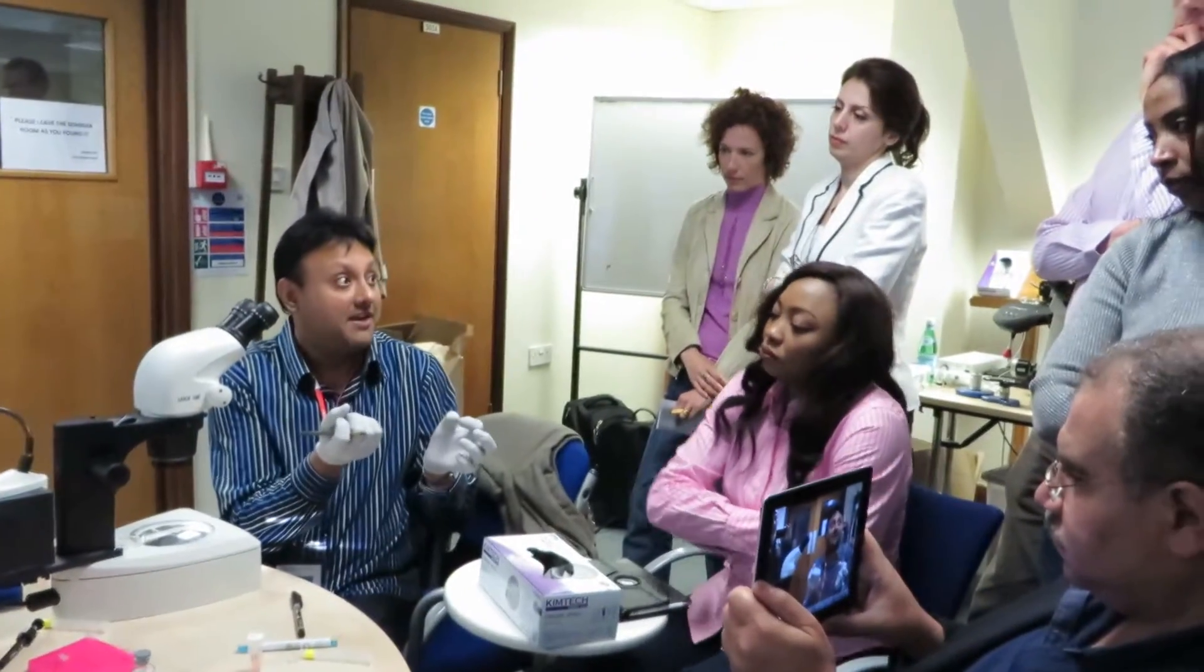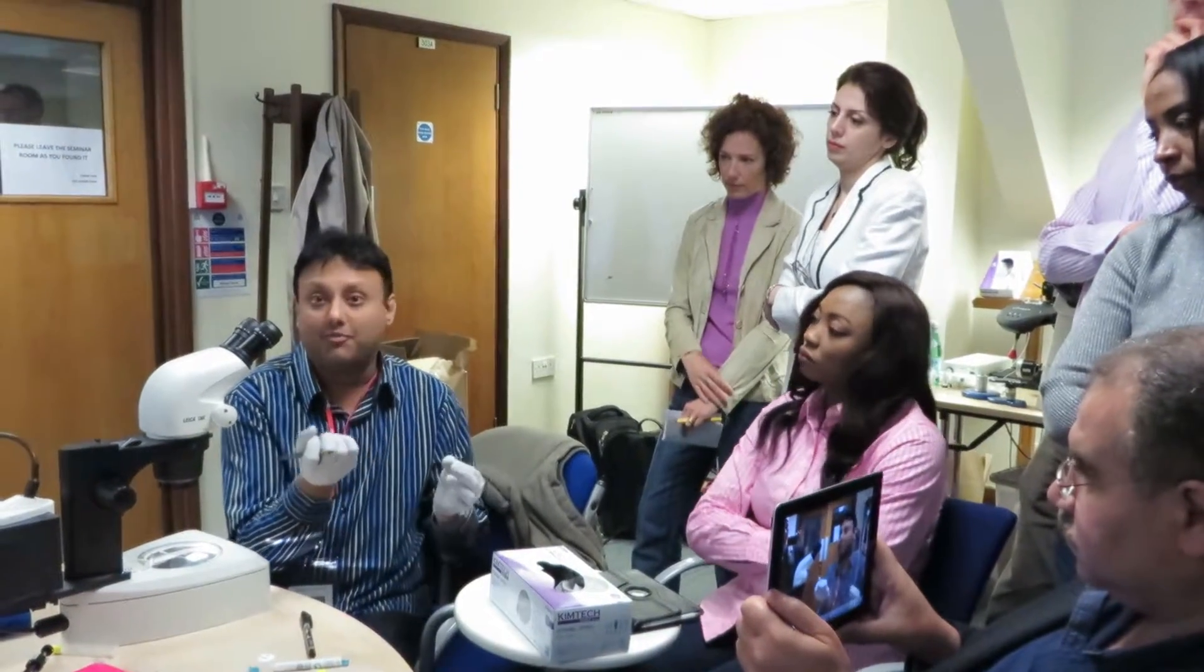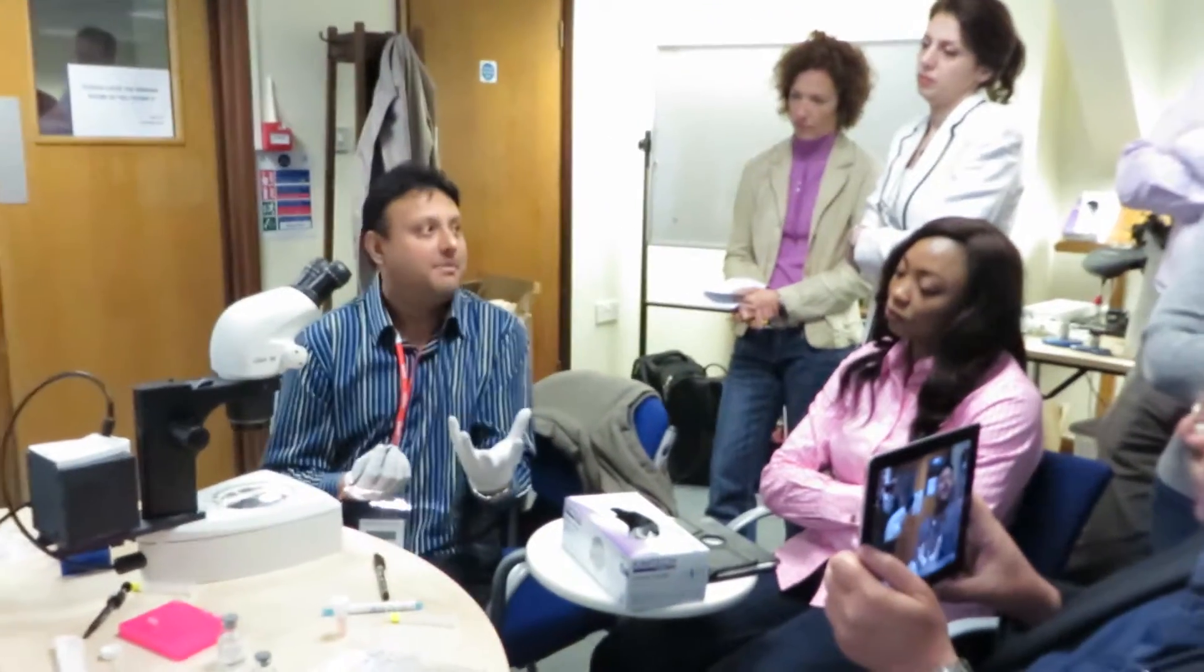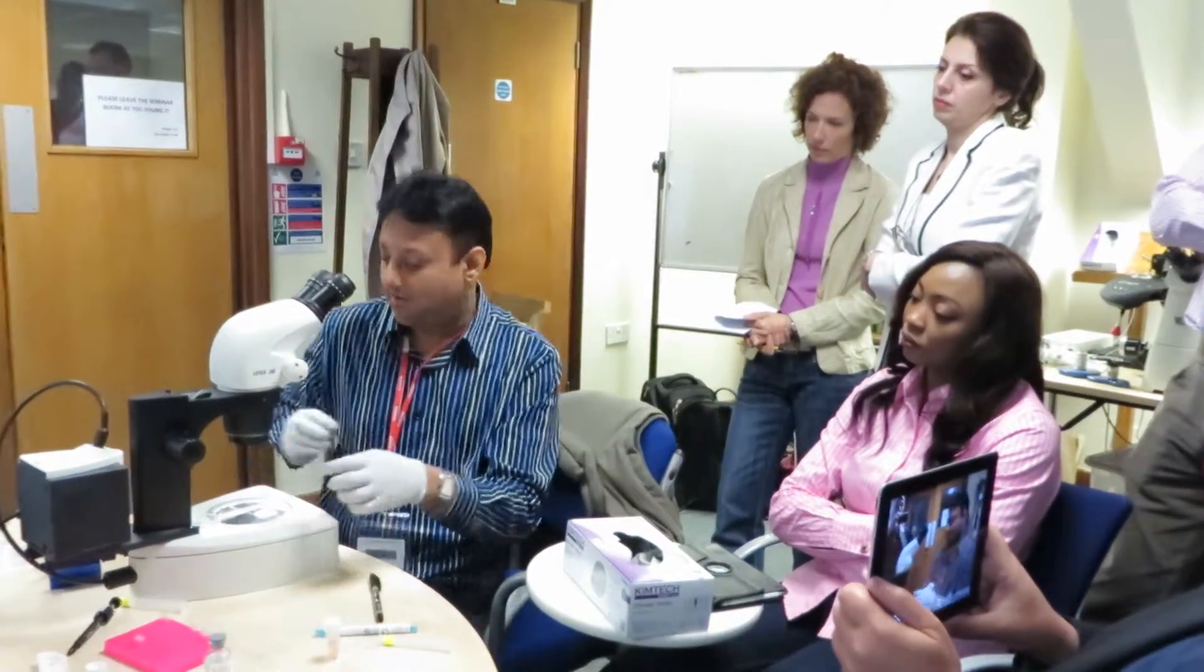As you know, the FISH probes are very tiny in amount. You literally put one microliter or even less, so it needs to go in a very specific area. You can't draw a very big circle because the probe is not going to be enough to cover that whole area. So your circle has to be quite small.